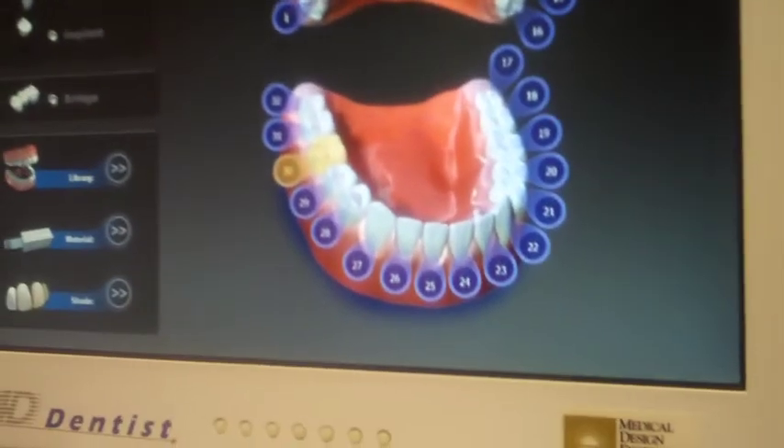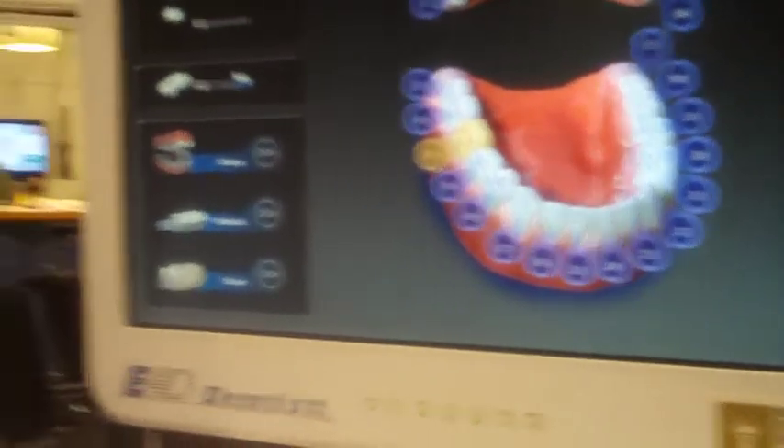So I've picked 30 — crown, inlay, onlay, veneer, thin veneer, implant crown — and this is a temporary bridge material. The update in the software for these functions is probably going to come in about a month or two.